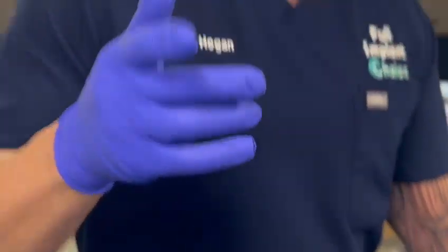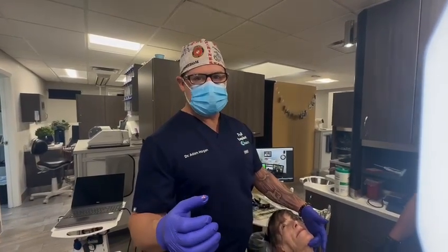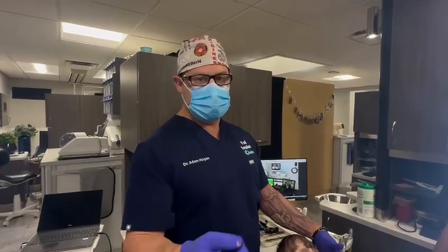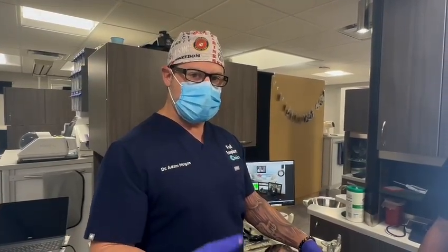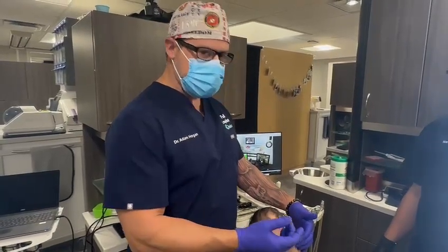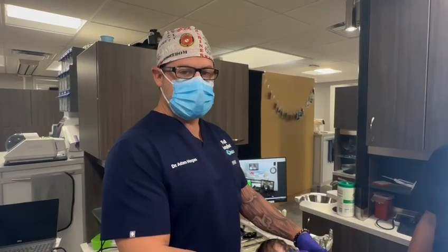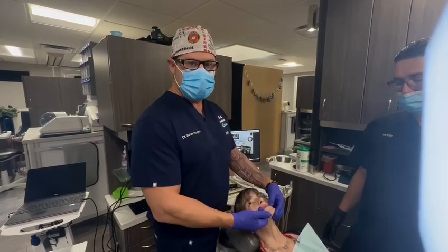So what we have to do, again, is establish proper vertical dimension at condylar centric. We've used that putty three times. Once we closed her in, I thought she was over-closed. I added a couple millimeters, closed her in, still thought she was over-closed, added a little bit. We closed her in, we thought it looked good. So now we're picking up the rugae detail for alignment purposes. From here, we can take her to the CT scan and double-check the condyles, use this for a facial scan, for photos, everything to design teeth digitally according to the facial scan.